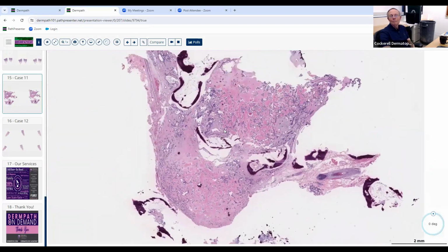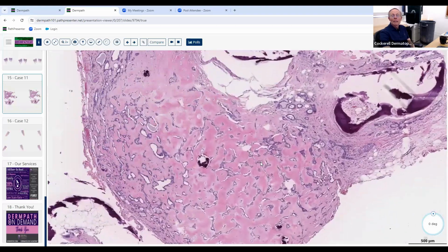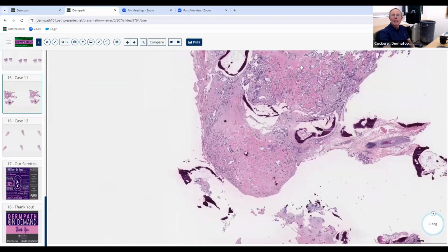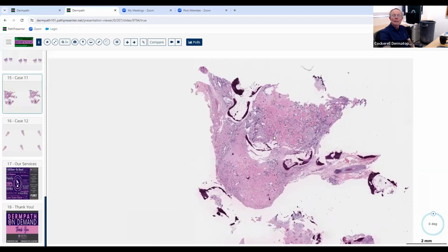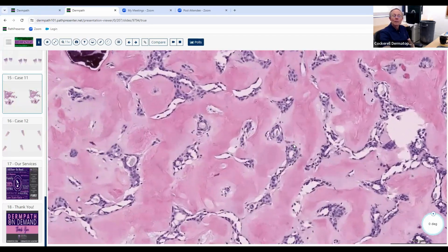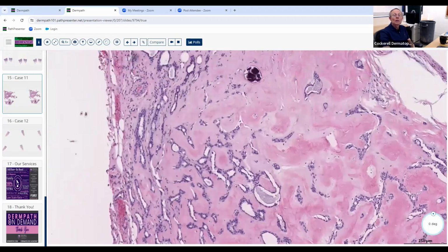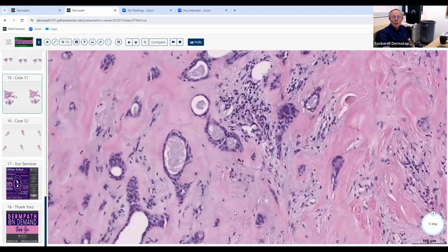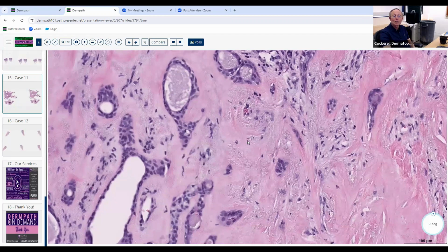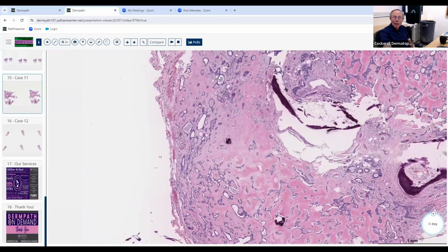Well, once again, don't do that. Look at the whole picture. So yes, there is osteoma cutis here. There's ossification, but there's this other process going on, and you've got this neoplasm that basically enucleated out here, and it's got these little small duct-like structures of epithelium with this background pink collagen, and in some areas, you're going to see mucin and some cartilage-like change over here, cartilaginous metaplasia. So this is an example of a mixed tumor, chondroid syringoma is the other name for that.